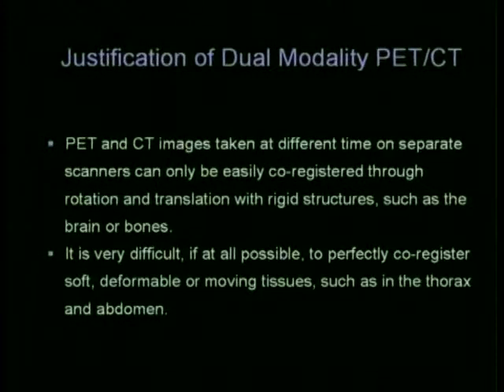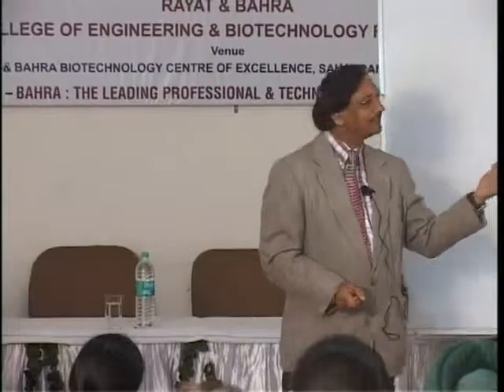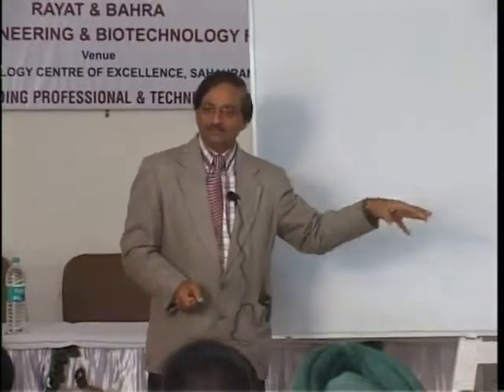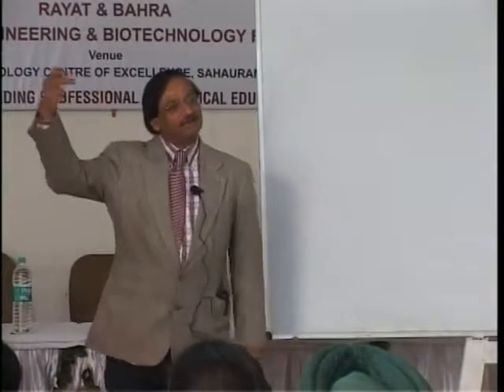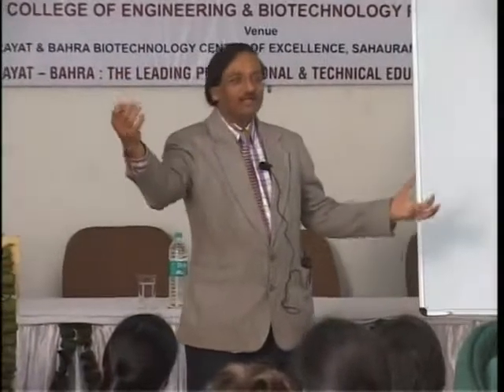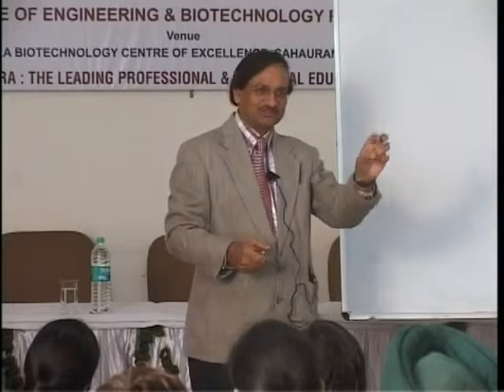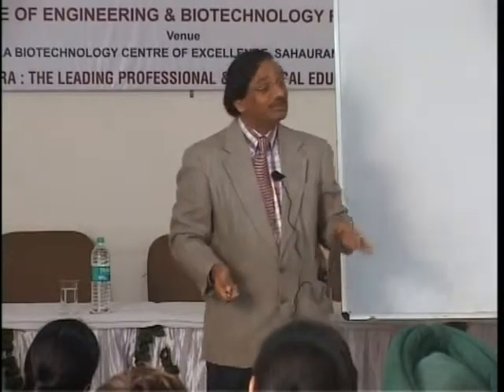When the structure is not moving, then it's possible. You acquire data today at, say, PGI and you did a CT, and you take a PET CT somewhere else, say in Amritsar, tomorrow, and you send these two images and try to fuse them. It is possible when the structure is fixed. Like the brain, it's a fixed structure. It's a bone, it's a fixed structure.